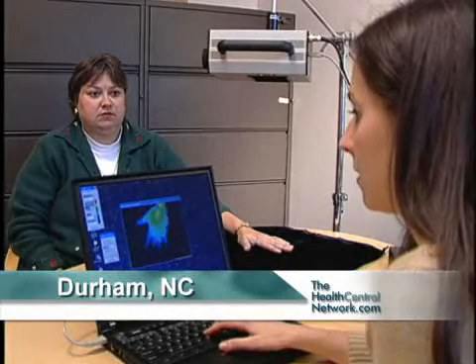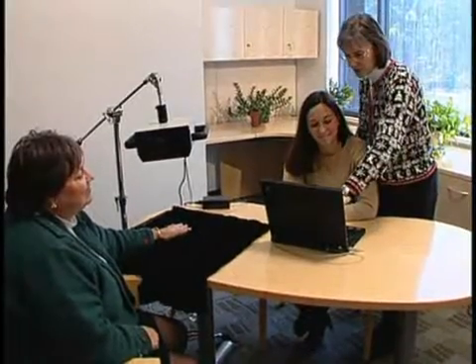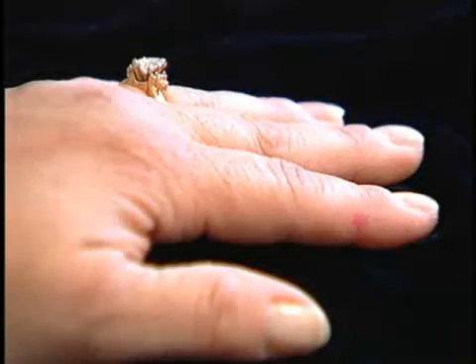That one looks pretty good. New technology gives Tina Height a chance to see something a normal x-ray can't. Using thermal imaging, researchers can tell if she has early signs of arthritis in her hands.